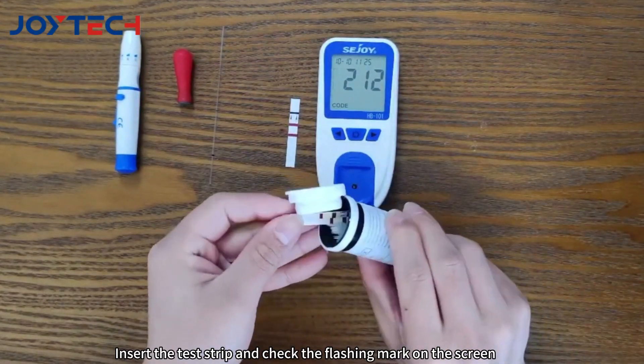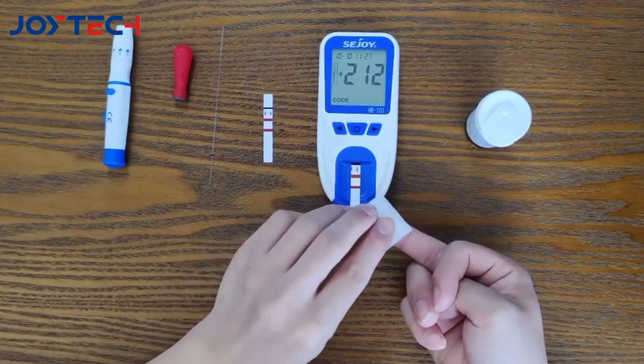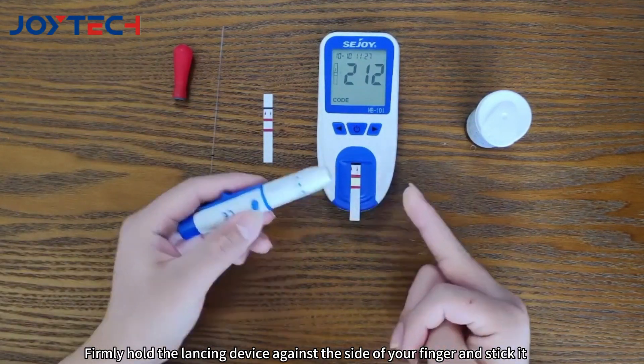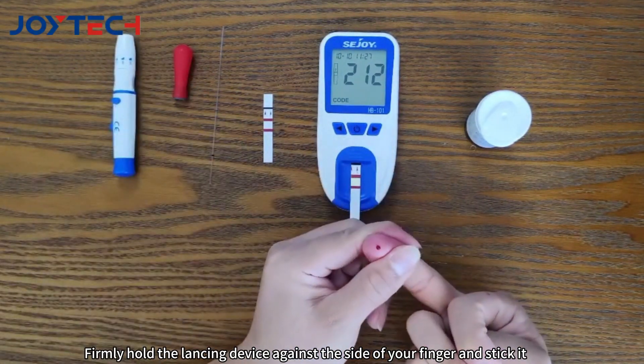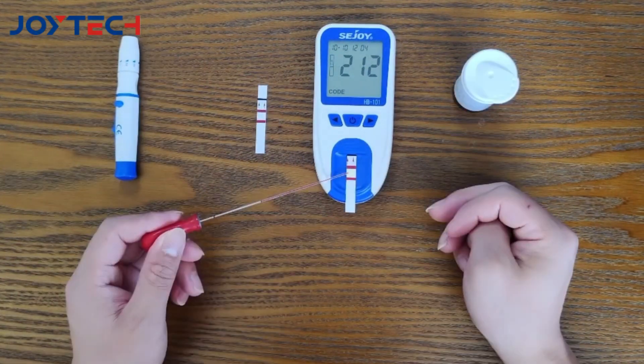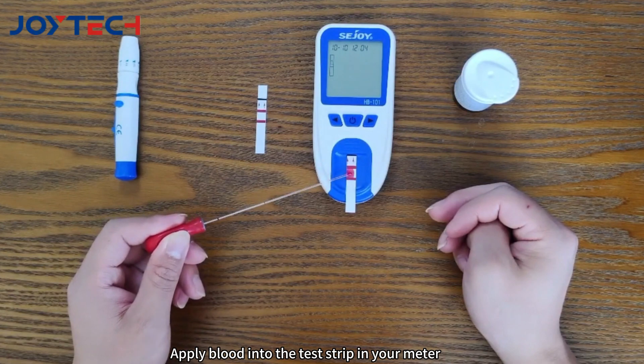Insert the test strip and check the flashing mark on the screen. Clean your finger and wait for it to dry. Firmly hold the lancing device against the side of your finger and stick it. Apply blood into the capillary tube until it reaches the tick marks, then apply blood into the test strip in your meter.